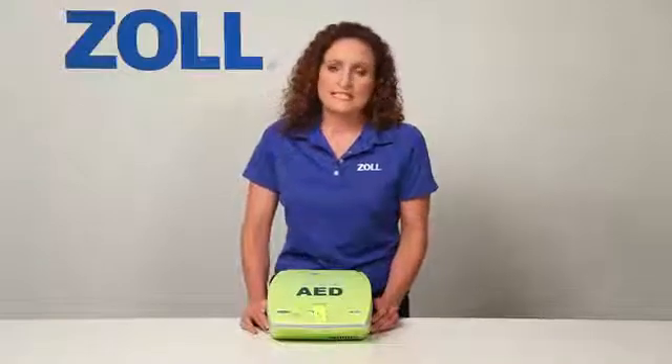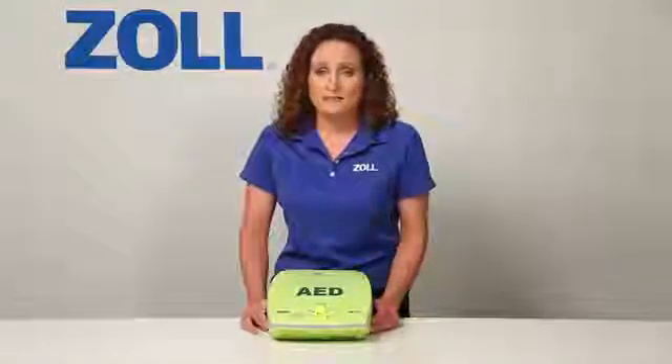Once your AED says no shock advised, only CPR can save the victim. At that point, you have to ask: will my AED support my CPR by guiding my rate and depth? If you're not using this AED, the AED Plus, it won't help much at all.